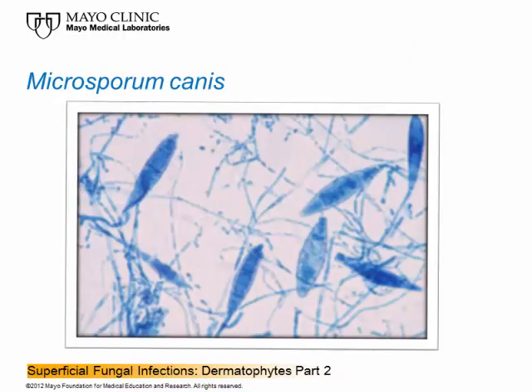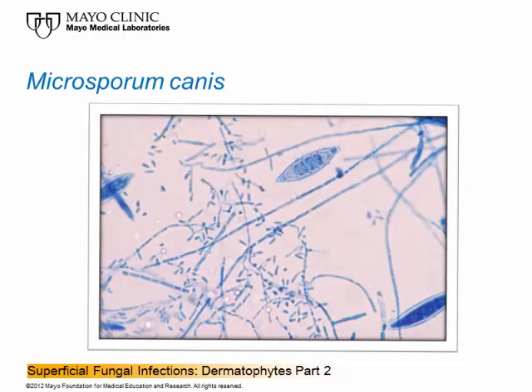This is an example of Microsporum canis. All these are macroconidia, but look in the background — you see some small things there. Those are microconidia of Microsporum canis. These have multiseptate macroconidia. It's a little difficult to recognize the rough-wall projections on this particular slide. At the tip of the macroconidium on the upper right-hand side it's a bit curved and just a little bit rough. You have to scour the whole culture to be able to identify these organisms because they don't always sporulate as expected.